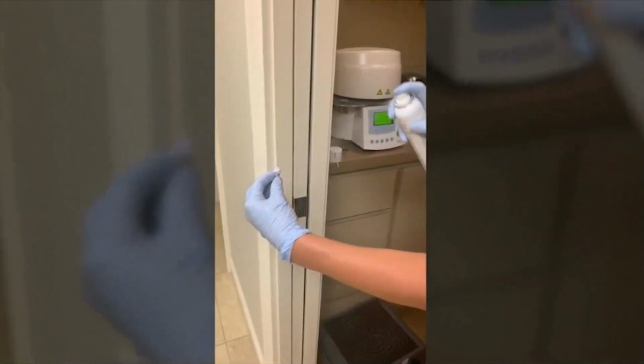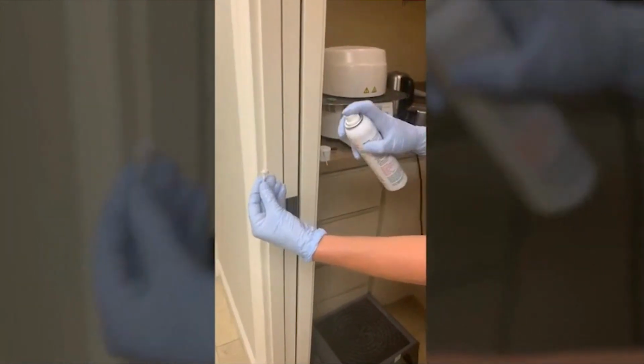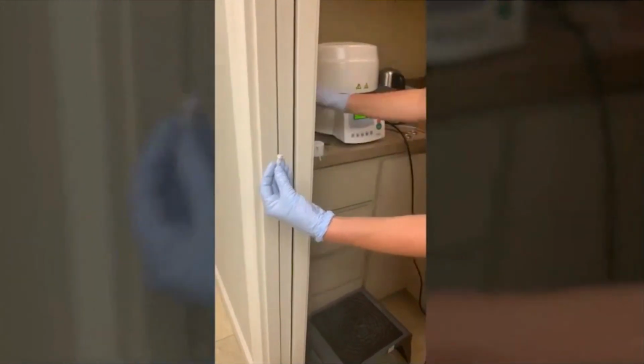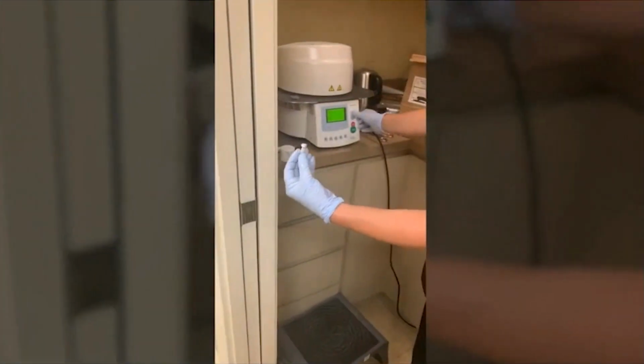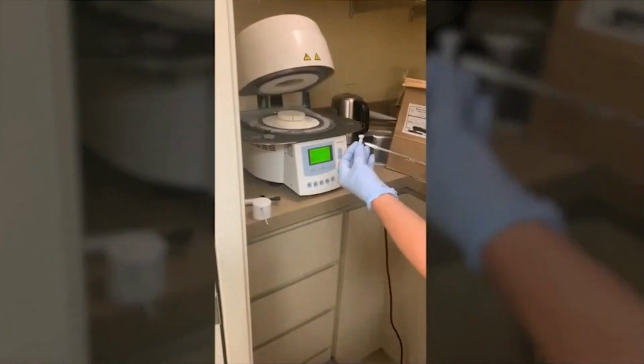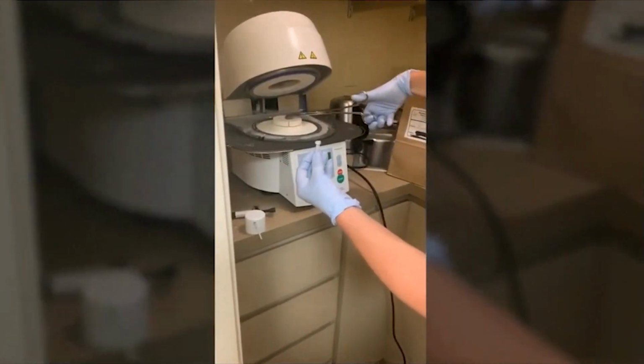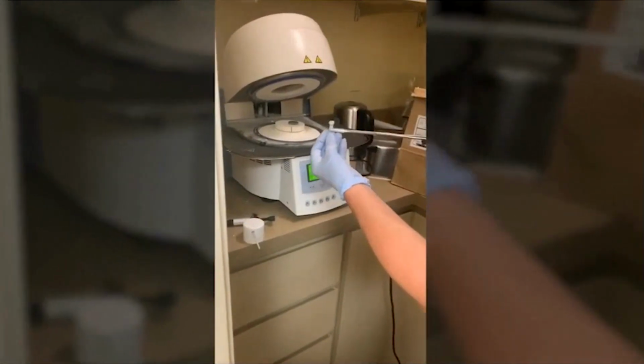Sometimes I'll put some stain in the grooves or something. Not very often. Again, patients will look at it and say, oh, I have this beautiful new crown and, you know, all this stain on it. So it's great for anteriors to put a little character into the restorations. But on posteriors, I usually just glaze and put it in the oven.